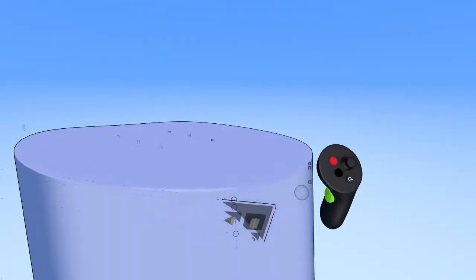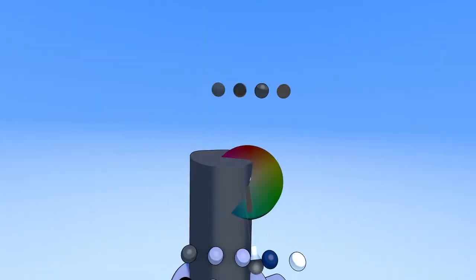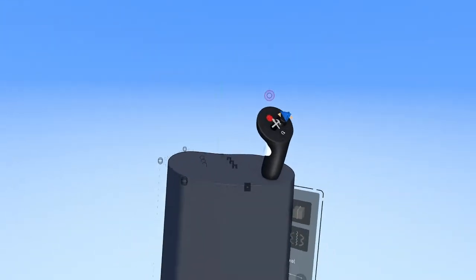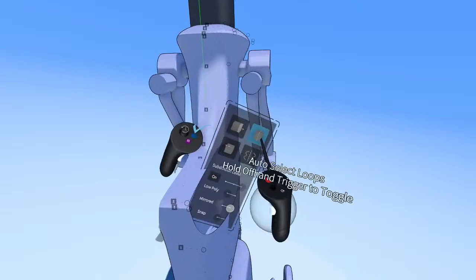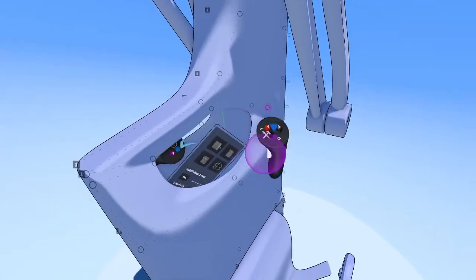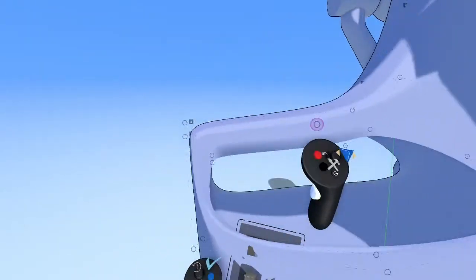Okay, so this is our sensor housing. I want a pretty tight radius up here. And yeah, now we can drop that down like this, make it dark. And let's do that shelf that I was talking about earlier here. I'm just going to select the entire row of edge loops like that, duplicate it in, shift some points around, like this. Here and here.